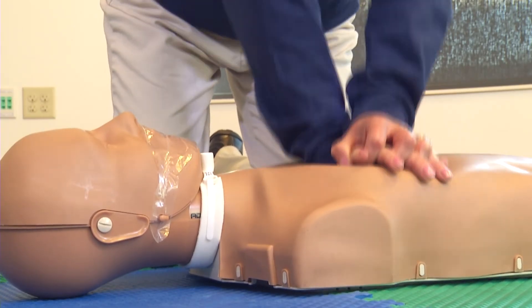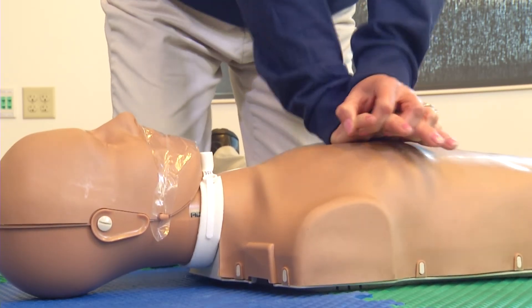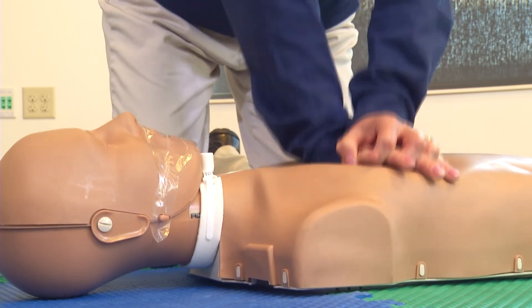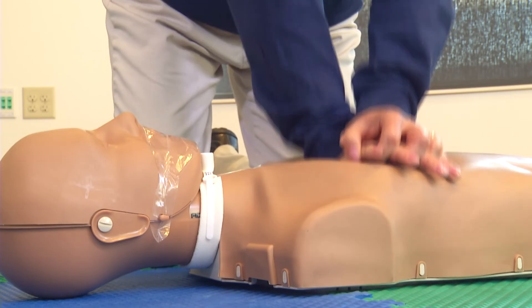1, 2, 3, 4, 5, 6, 7, 8, 9, 10, 12, 13, 14, 15, 16, 17, 18, 19, 20, 21, 22, 23, 24, 25, 26, 27, 28, 29, 30.